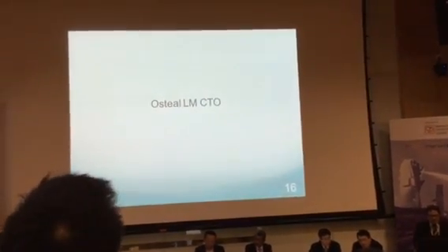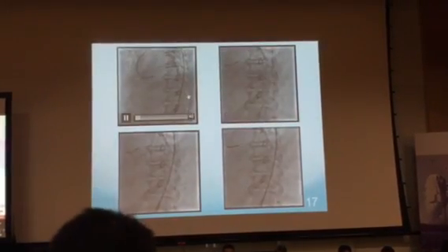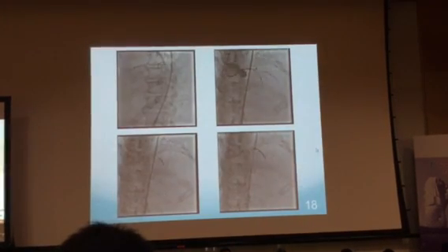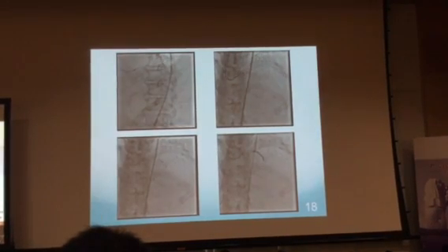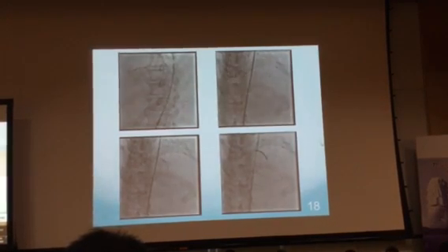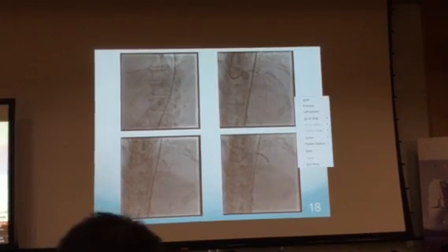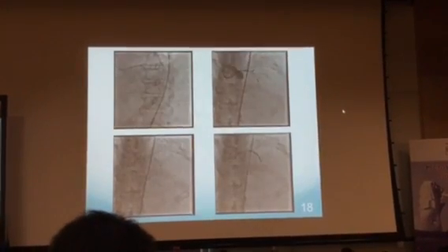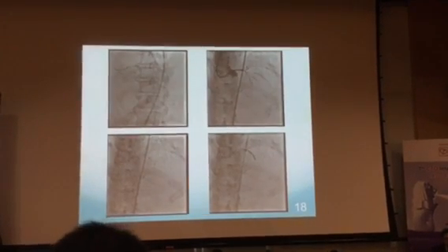This is a very interesting case, a case of ostial left main CTO. As you can see here, the CTO is just at the ostial of the left main. Sorry, let me go back to the previous slide. Okay, sorry. Yes, this is just the ostial of the left main.